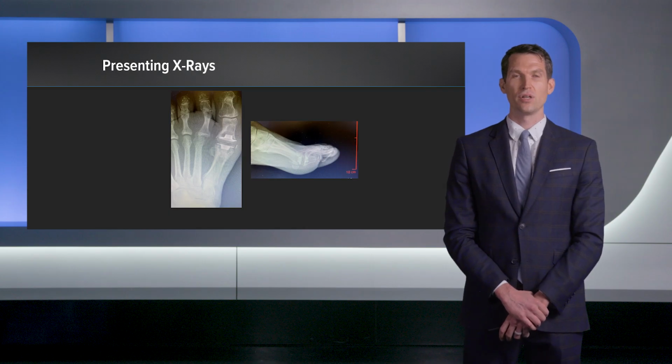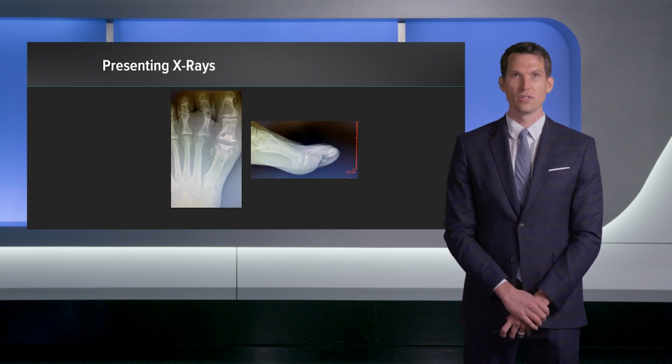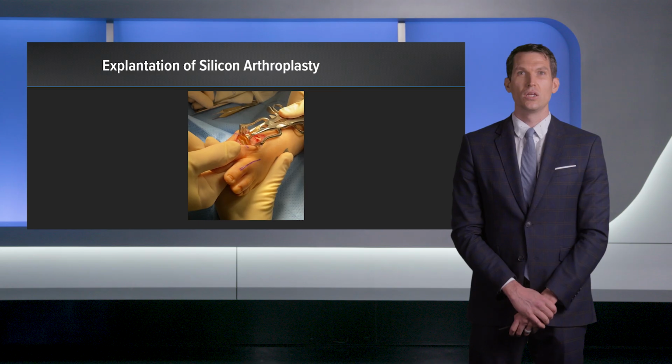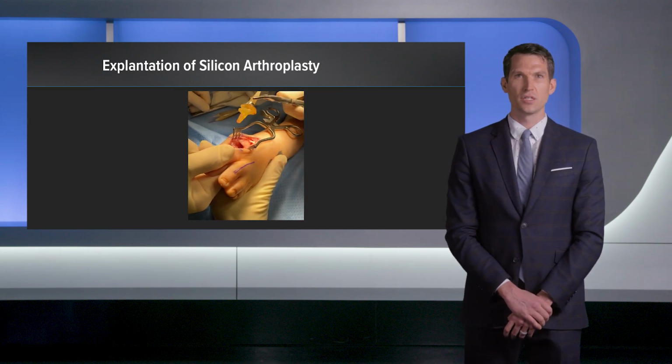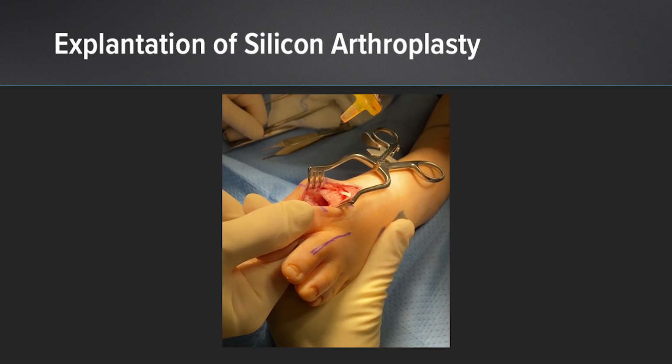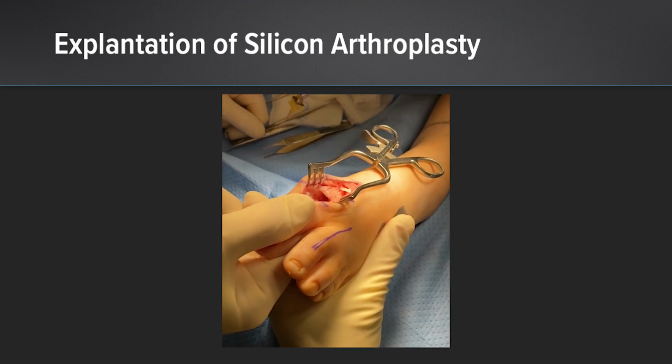Here are presenting X-rays, which demonstrate a silicone arthroplasty with surrounding osteolysis, as well as a second metatarsophalangeal joint, which is dislocated. Intraoperatively, here you can see explantation of the silicone arthroplasty. There was no evidence of bone ingrowth, as one would expect.